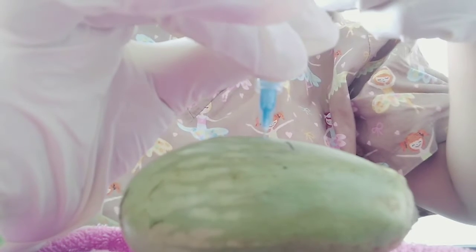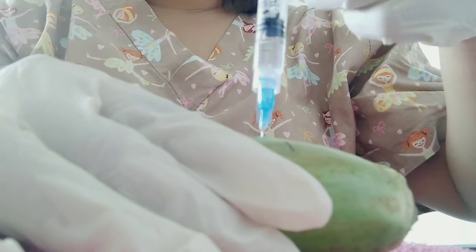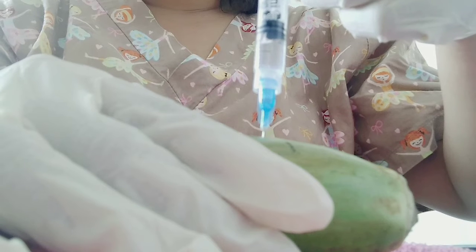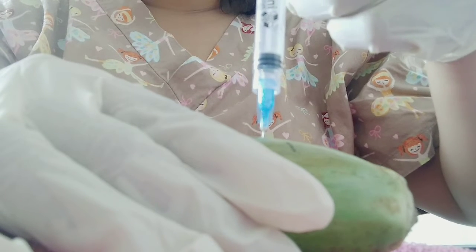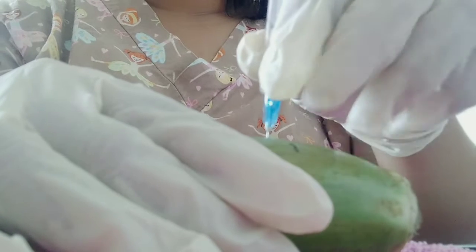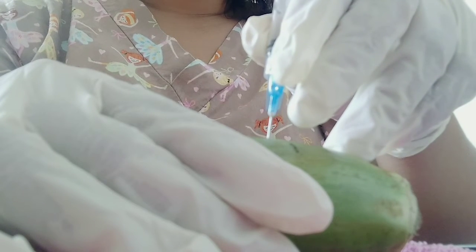Then you are going to inject the medication. Then slowly remove the syringe.